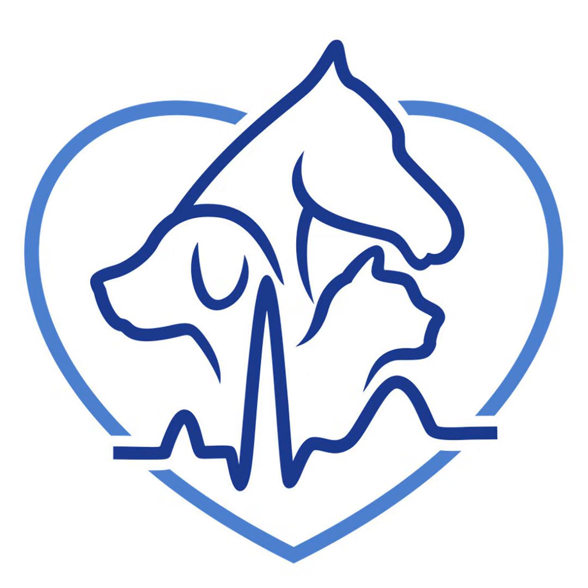We now have started to select for cats that we think are in this gray zone where we don't really know what they have. So if phenotypically we're calling it normal and we have no questions about that, I think it's hard to underestimate wall thickness. It's possible, but it's not as common. That cat probably isn't getting teed up for a catheter and some contrast. Same story on the extreme end. If the cat comes in and its wall thickness is 8 millimeters and its left atrium is 20, we know that that cat phenotypically has a disease that this isn't going to help us differentiate from.